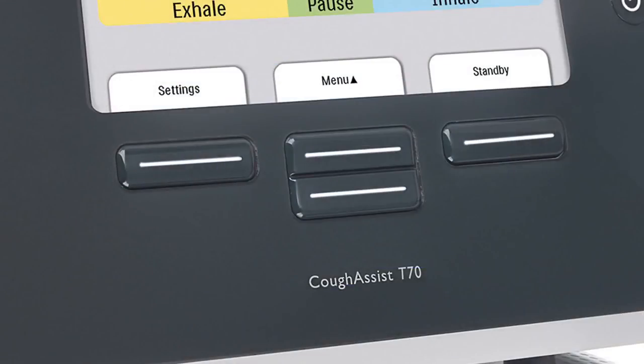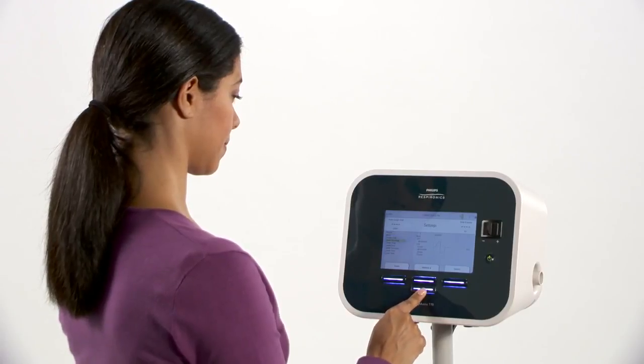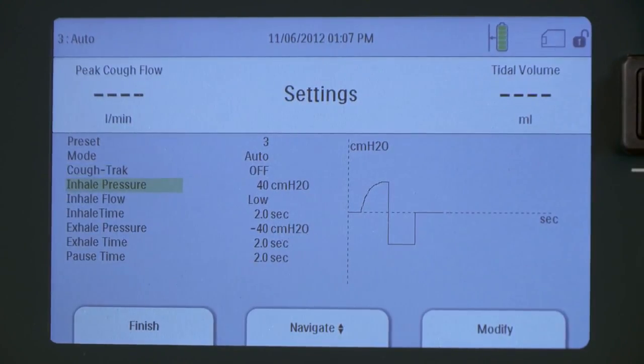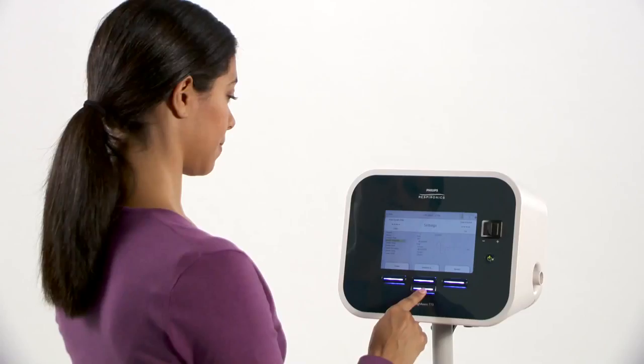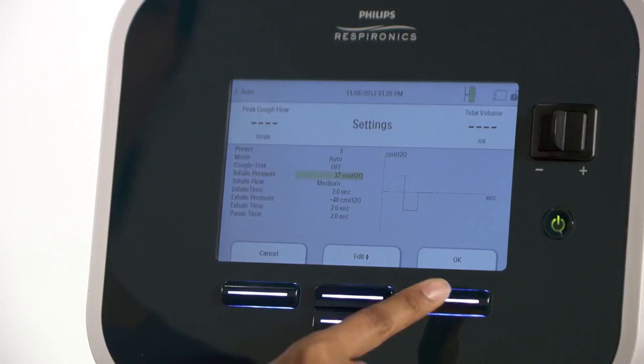You can select other settings by using the center navigate buttons. Let's say you want to change the pressure temporarily while a patient is being introduced to treatment for the first time. Use the center up-down button to move down the list until inhale pressure is highlighted. Press on the right button under modify. Use the center up-down button below edit to lower the pressure to the new setting.